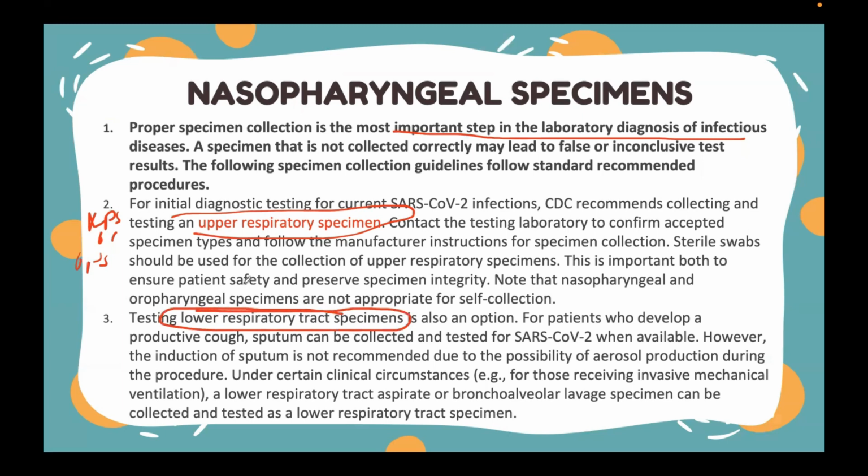These are the patients that have been hospitalized. Pagka mga comatose patients, or may mga hindrances na hindi po natin sila maswab through nose and through mouth, we can collect samples sa lower respiratory tract. And ano-ano po yun? Yung mga sputum samples po natin. Okay? Pagka talaga namang severe yung cough ni patient, pwede po natin gamitin yung kanilang mga sputum.